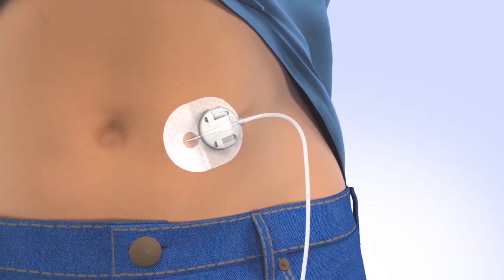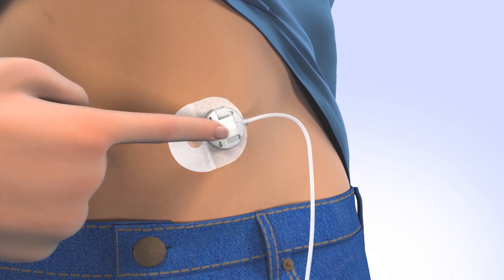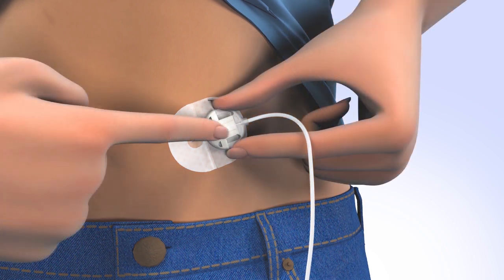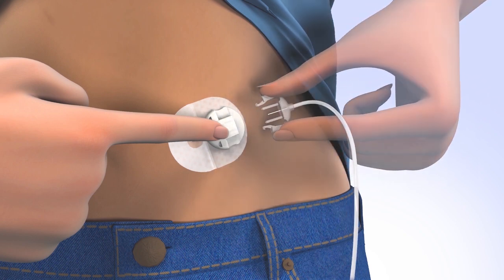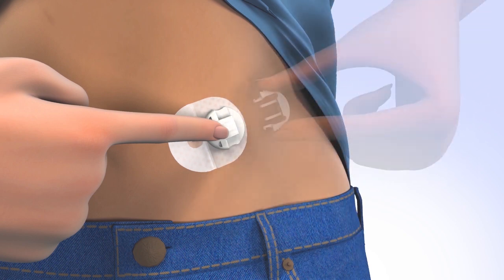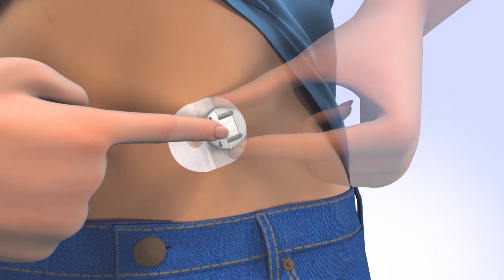From time to time, you will need to disconnect from your infusion site for activities such as bathing or swimming. For your convenience, the Silhouette Infusion Set allows you to temporarily disconnect from your pump. To disconnect, place a finger on the cannula housing. Gently squeeze both sides of the connector and pull the connector needle straight out from the cannula housing. To protect the infusion site, insert the disconnect cover by sliding the cover into the cannula housing until you hear a click.